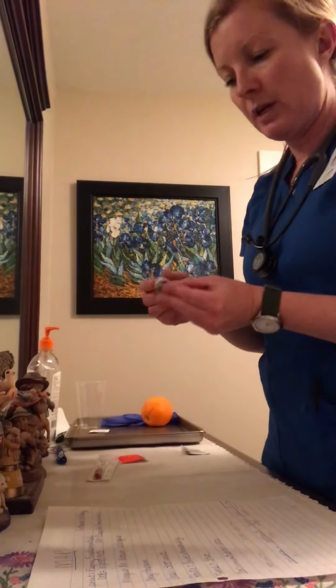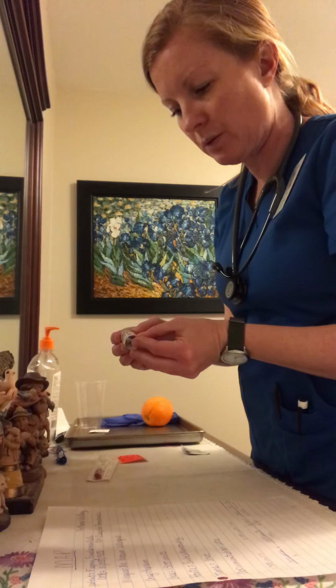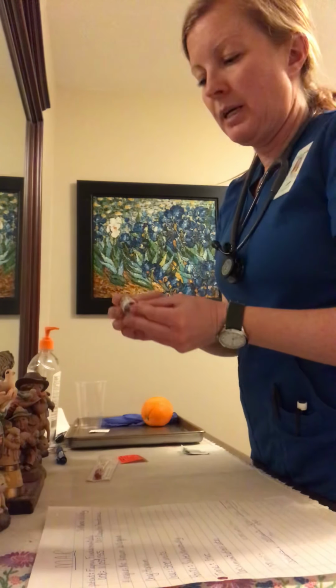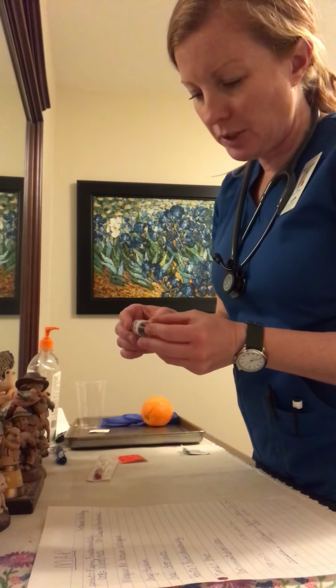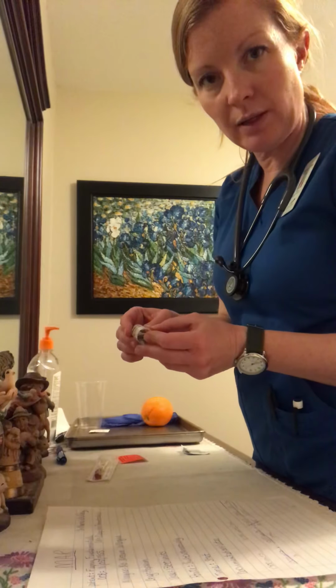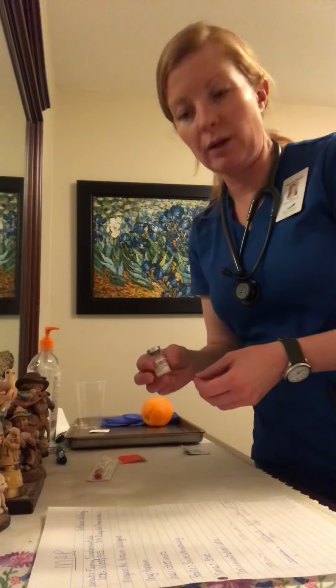We're going to check for the manufacturer's expiration date. So 02/2028, we're good there. Since it's been opened, we would check for a written expiration date, and it looks like an expiration date of 5/10/2020 is on here, so we're good there also. If there was no written date, then we would throw this one away and get a new one.